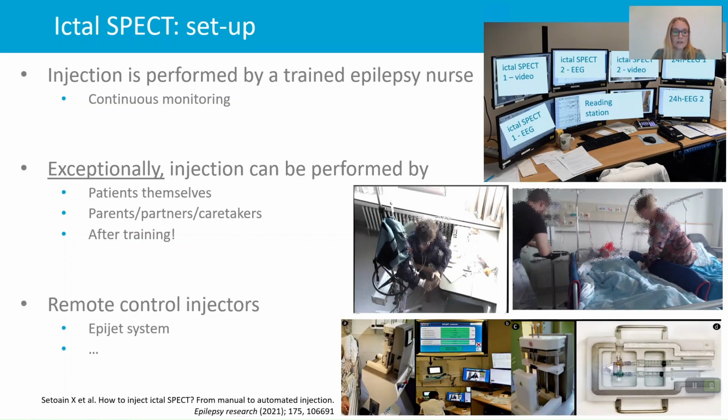Then if you look at the literature, there is also quite something going on about remote control injectors, which means that from the monitoring station you could press a button which will start the injection. These are pictures of a quite recent paper from the group of Barcelona, which used the commercially available EpiJet system. We don't have any experience with it, but it's for sure something to look into, to be able to have even more early injections happening.